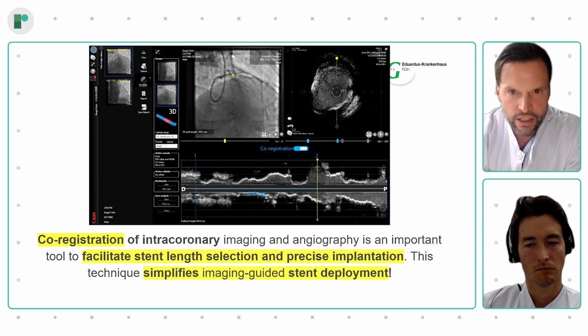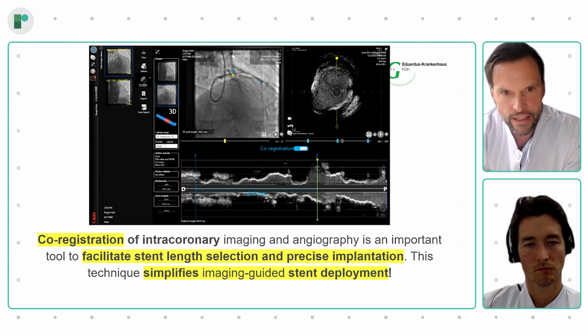This is always the discussion that we have if it comes to imaging, or advanced imaging, that of course it takes 2 or 3 steps. And then somebody says, yeah, but this is time consuming. Of course, you must take 2 or 3 steps, but at the end, it's time saving, because you have just 2 angiograms, you have 1 IVUS pullback, and then you have every information you need. You just travel along your vessel, and then you can plan your strategy, and that's it.